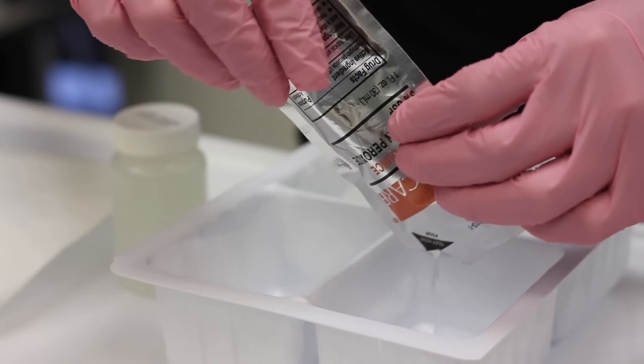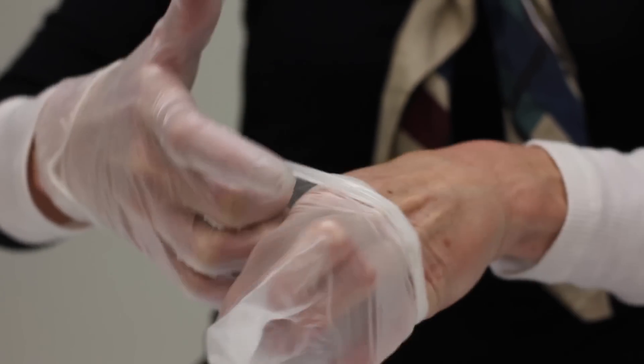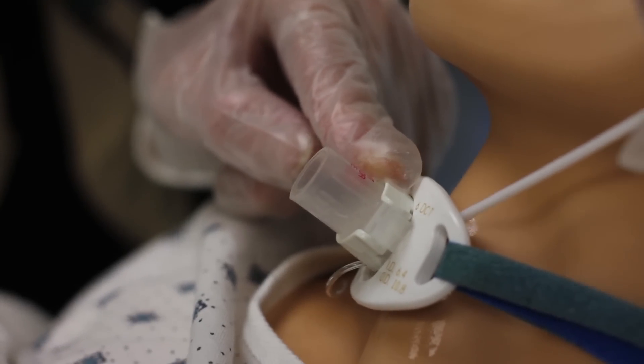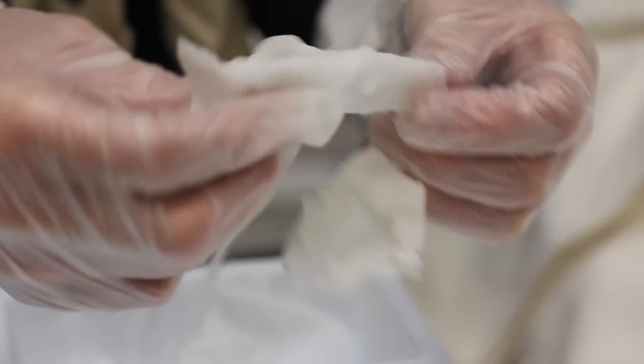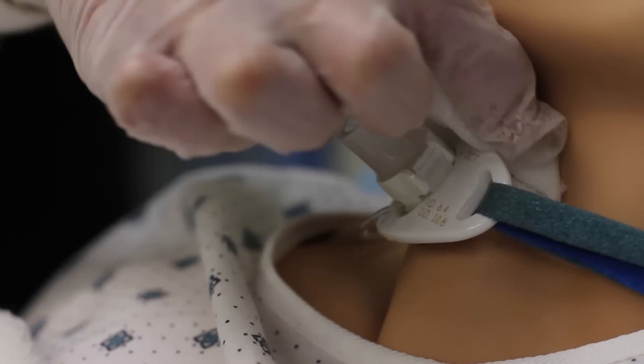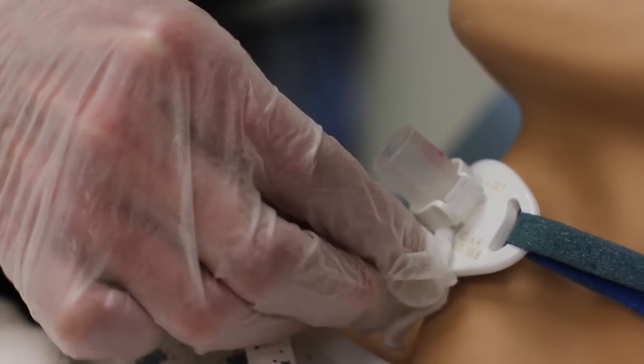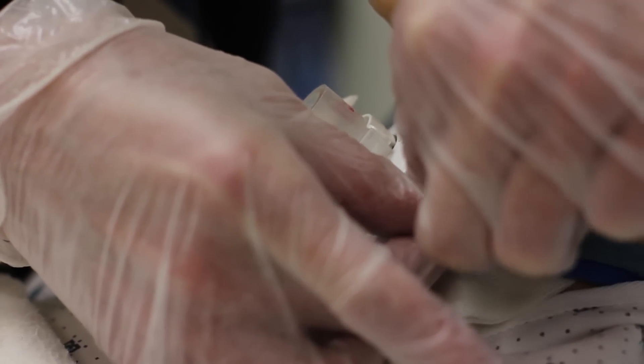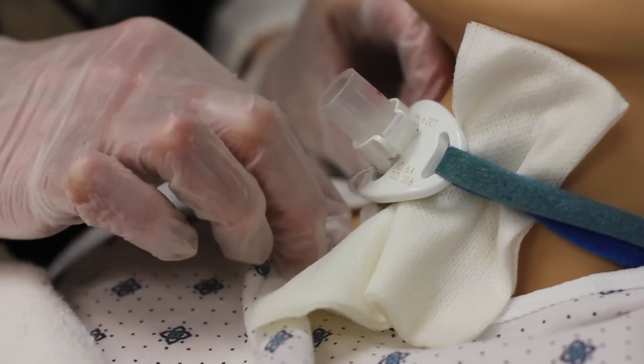To clean the external stoma, skin, and change the trach ties: pour normal saline and hydrogen peroxide in a one-to-one solution into a sterile bowl, then put on clean gloves after washing your hands thoroughly. Using moist sterile applicators like Q-tips and 4x4s, clean around the stoma, removing any dried blood, mucus, or debris. Apply prescribed medication around the stoma if ordered. Then apply a drain sponge per ENT orders — on a new trach, the drain sponge may be applied only after sutures are removed per ENT orders.